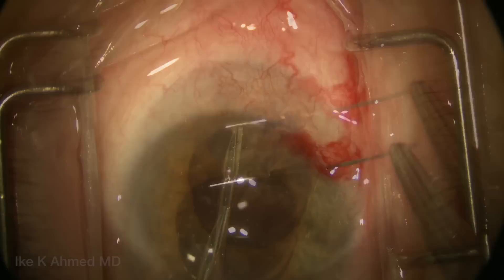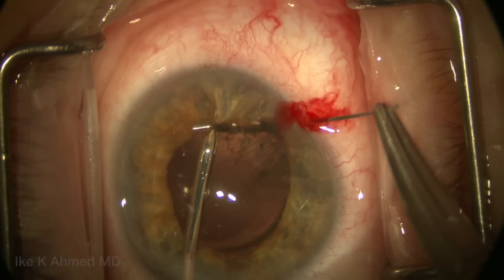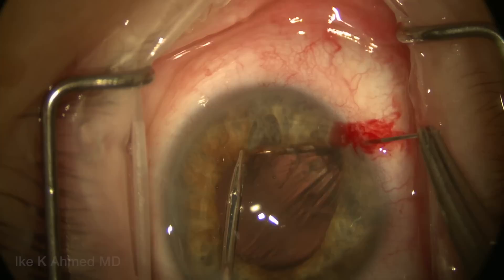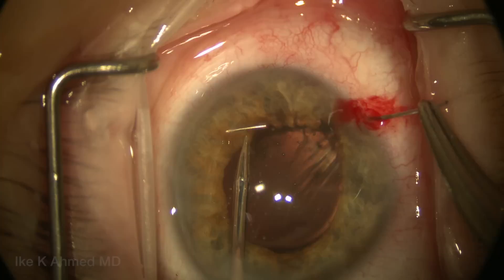The bites are just about a millimeter or less from the pupil edge itself. It's important to note that the suture needle is maneuvered into the anterior chamber and the micro grasper presents the iris tissue to the needle to facilitate its passage. It's very important, as we work in this closed space, to use the incisions as a fulcrum to prevent corneal stria and rotation of the needle — control is afforded by these micro instruments.